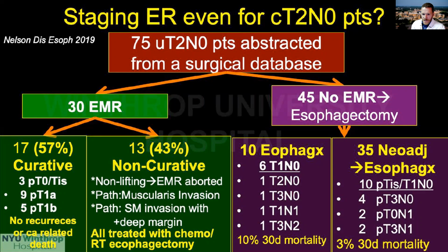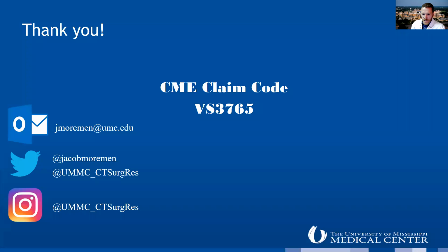So it's something to consider, that even in these that look like a T2 by ultrasound with muscular invasion, it might be worth endoscopically taking a swing at these first to try and spare some percentage of patients an unnecessary esophagectomy. So that is all we have for today.